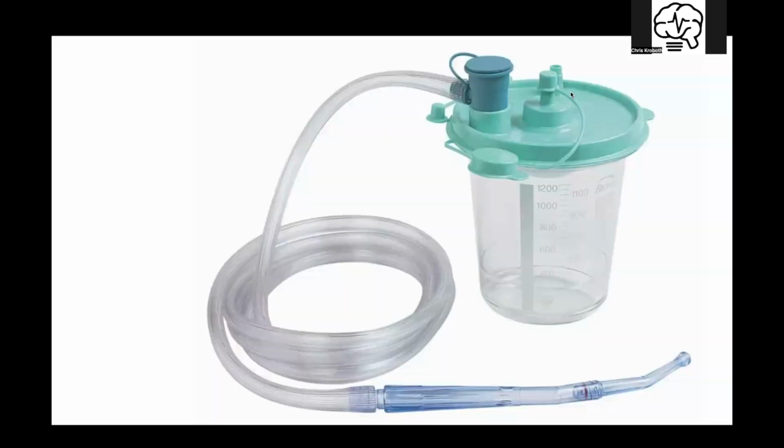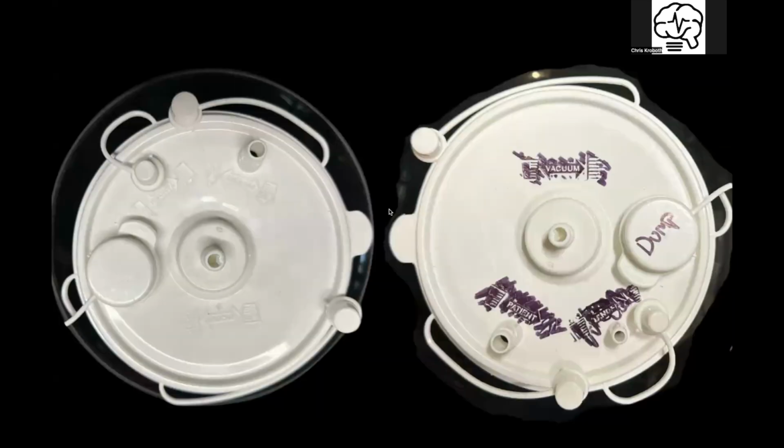So here's our suction canister. We've got our lid. We've got our 90-degree angle down to our suction tubing to our Yankauer suction. And the Yankauer suction is the one that came from the oral surgery community. So, a suction canister here. And let's look at what the top says. If you actually read the top here, it's printed in the same color as the plastic. It's almost impossible to read, especially at 2 in the morning when your eyes are all fogged up and it's dark out. So, if you take a magic marker here, and mark across the words, you can actually read.